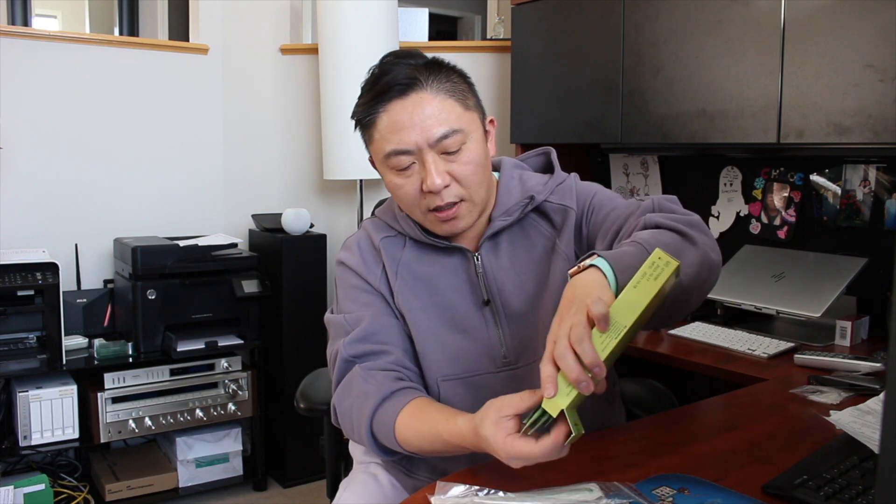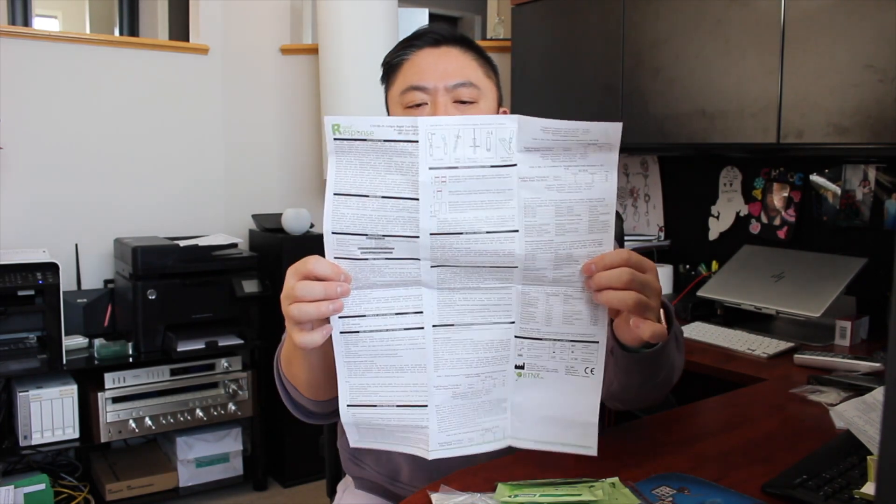We'll cut this open and empty out the contents. Inside we've got the detailed instruction leaflet in both English and French — simple step-by-step procedural instructions on how to do the setup, how to swab, how to activate the reagent, and ultimately how to put the test results into a cassette to confirm if you have COVID-19.